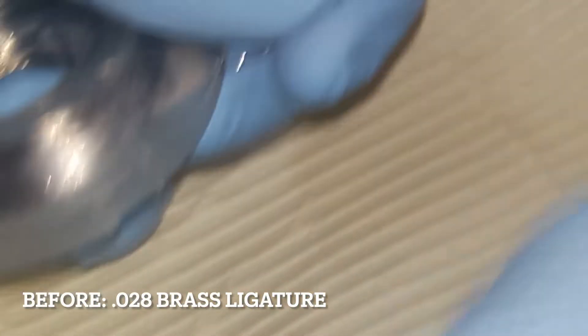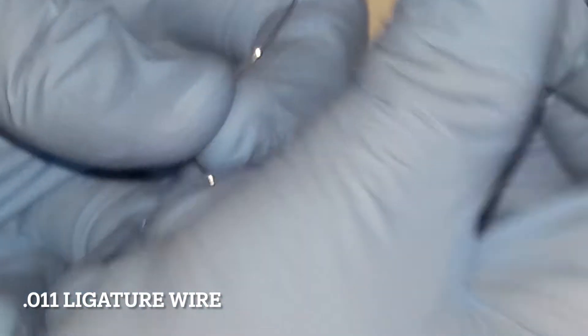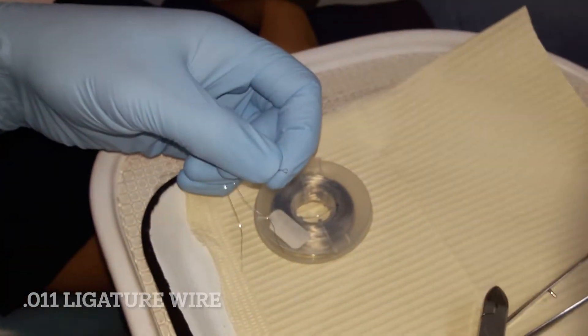When I started out with my orthodontic practice, the separator material was a 0.028 brass ligature wire. But brass ligatures are very difficult to find these days. I use a modified tooth separator by using a 0.011 ligature wire to replace the brass ligature.